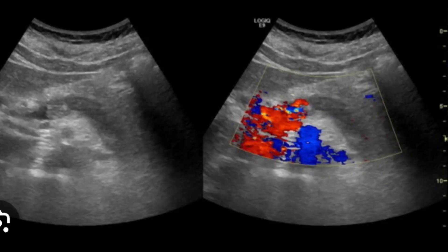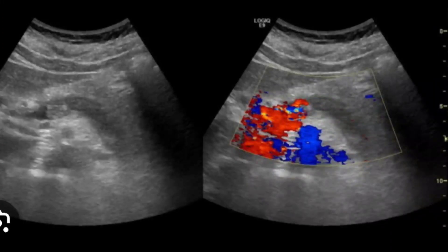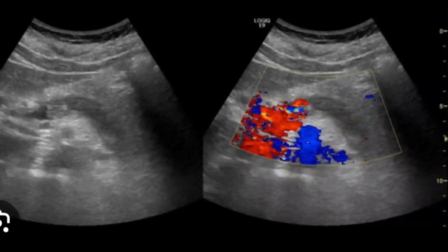This slide shows splenic varices — also called splenic collateral development. On the right side of this view you can appreciate that the splenic vein has thrombus in it. This is an extensive case leading to portal hypertension. You can use both terms — perisplenic varices or development of collaterals — to describe the dilated venous channels. This case shows perisplenic varices, collateral development, and thrombosis of the splenic vein, making it a case of portal venous hypertension.